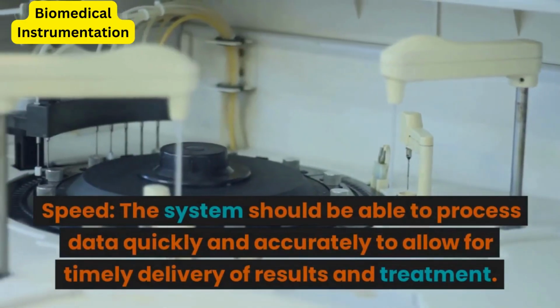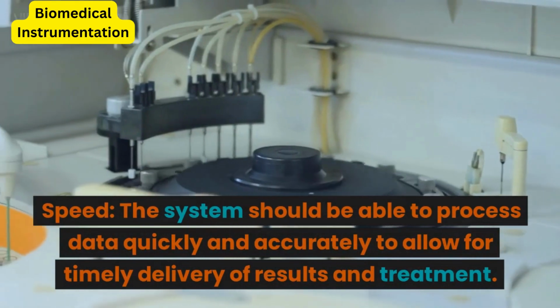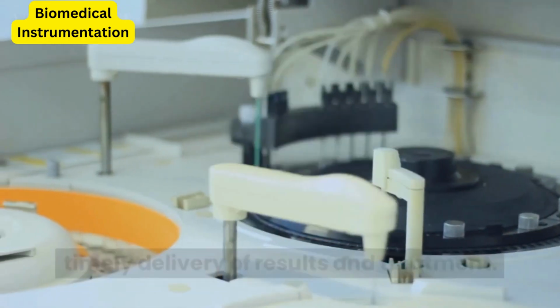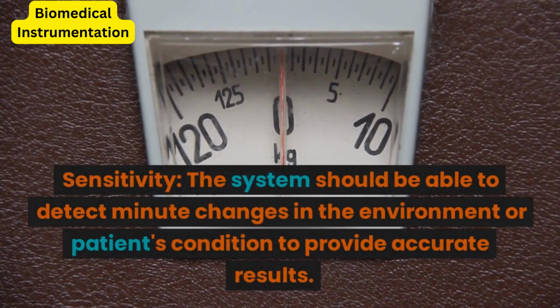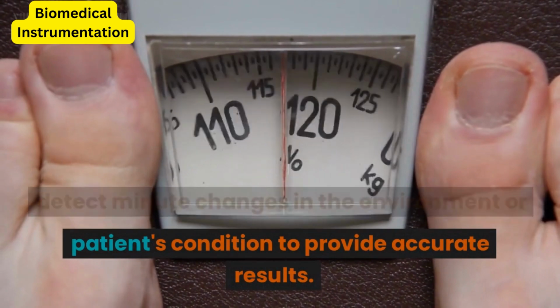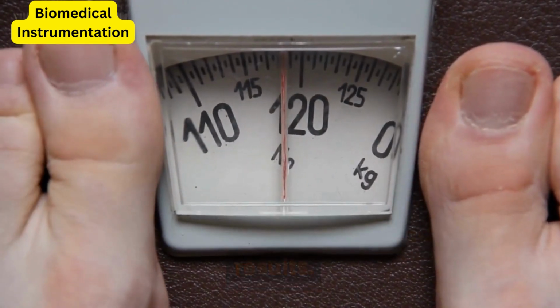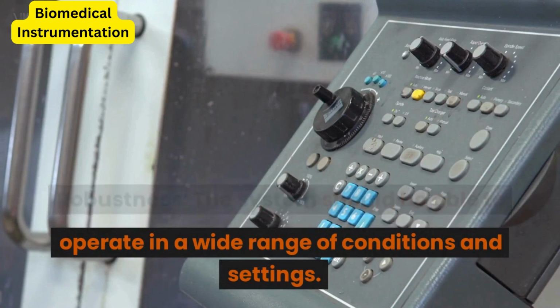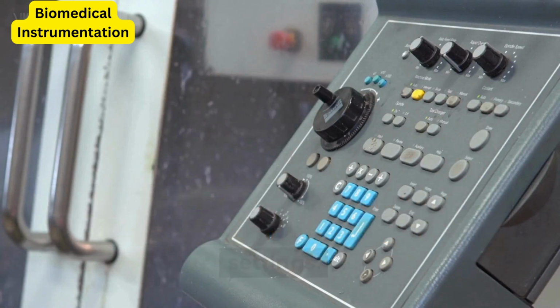Speed. The system should be able to process data quickly and accurately to allow for timely delivery of results and treatment. Sensitivity. The system should be able to detect minute changes in the environment or patient's condition to provide accurate results. Robustness. The system should be able to operate in a wide range of conditions and settings.